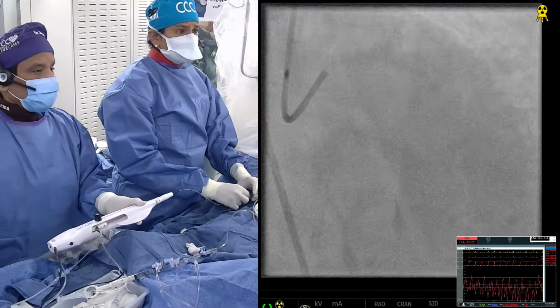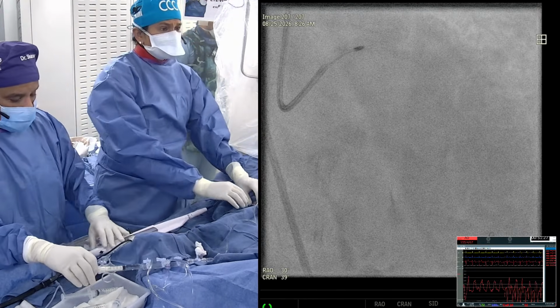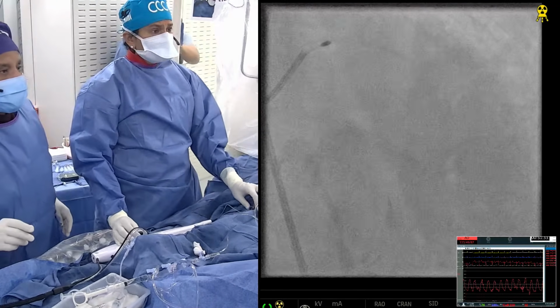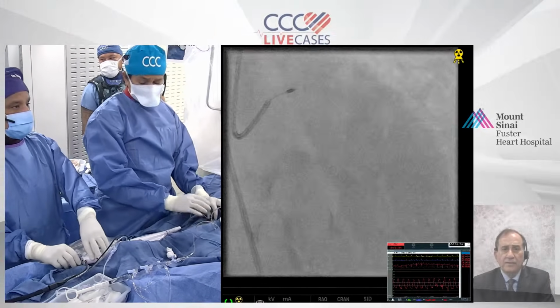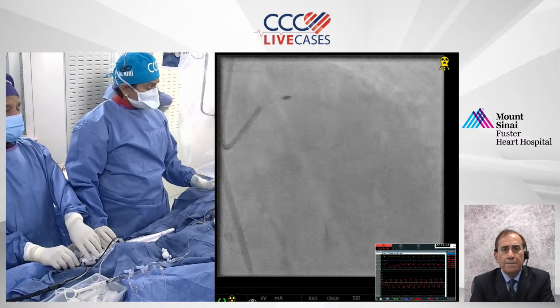And they are working on also that electric, just like our orbital. Let's pull back left main too far. Yeah. You should not be using the nitrogen and oxygen, and then just use the electric. I mean, another 2-part question. I think we'll let Anu use the rotor, and then I'll ask you.